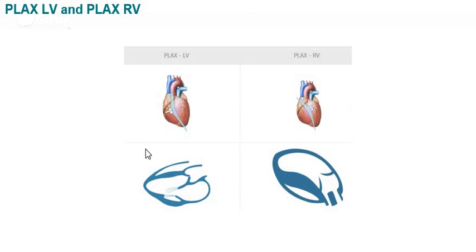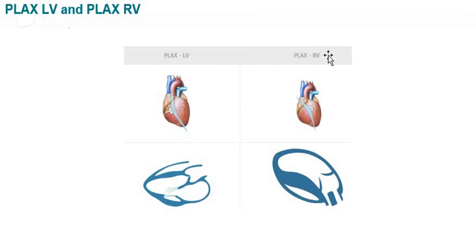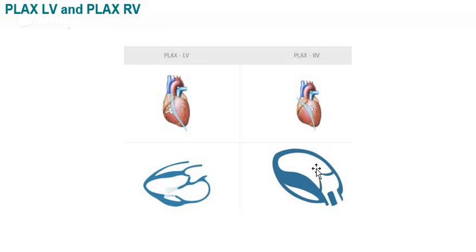The tricuspid valve can also be obtained using a specialized view. From the standard PLAX position, slightly rotating the transducer in the angular plane and depressing the probe toward the cephalic end gives what is called the PLAX RV view. The PLAX view is thus divided into two types: the PLAX LV view, to visualize the left ventricle, and the PLAX RV view, to visualize the right ventricle and tricuspid valve. Obtaining the PLAX RV view requires expertise, as it is a difficult view to achieve in most cases.